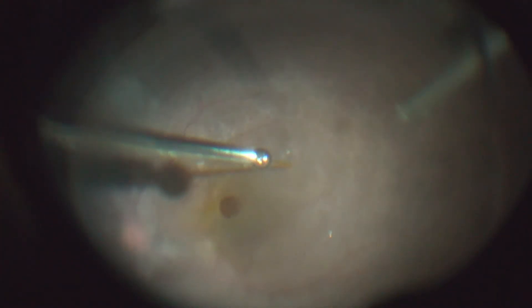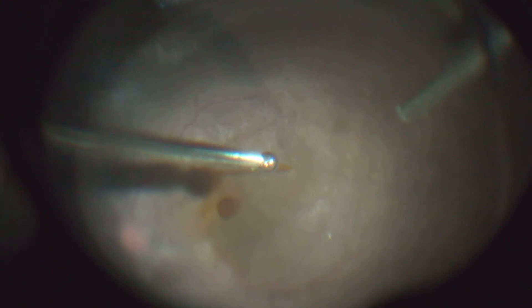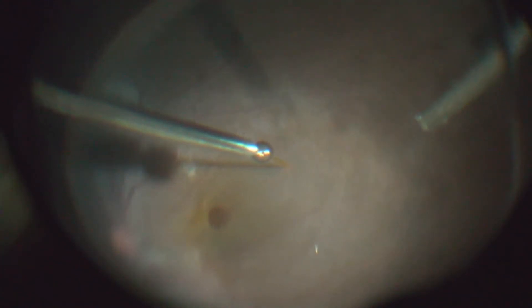Now I'm trying to aspirate this bubble by piercing the retina just above it, but with no luck. After multiple attempts I couldn't remove this bubble, so I decided to inject more BSS under the retina to get better space and then enlarge the retinotomy by manipulating its edges with the 38 gauge cannula so I can aspirate the PFCL bubble.